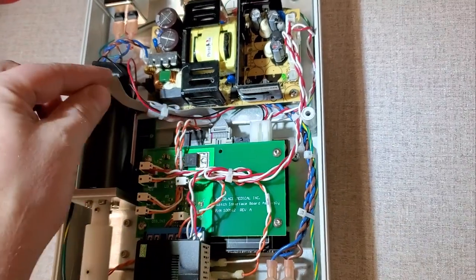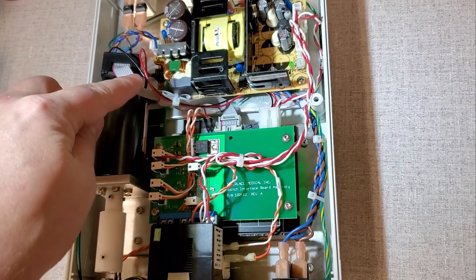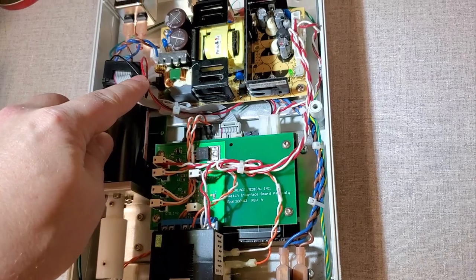This one here, in order to diagnose it, you could use a multimeter, I suppose, but the best way is an oscilloscope. Use an oscilloscope, guys.